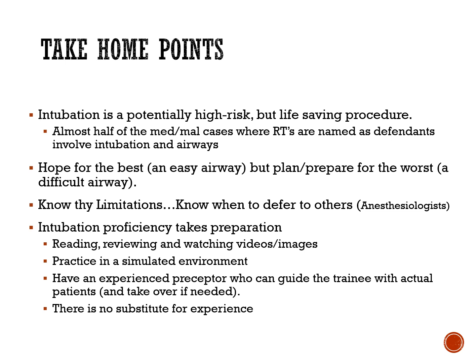If it turns out it's a difficult intubation, I may just have them watch. Just come back to me. I want you to watch what I do. I may want you to actually apply cricoid pressure, suction out the patient, et cetera. There's no substitute for experience, both as a trainee, looking at as many airways, assisting with as many intubations as possible, as well as if you're the actual intubator yourself.